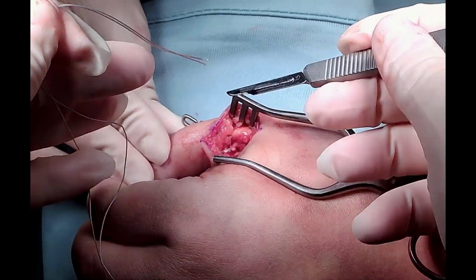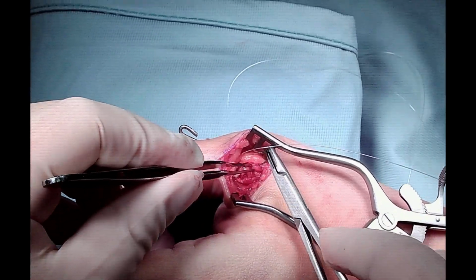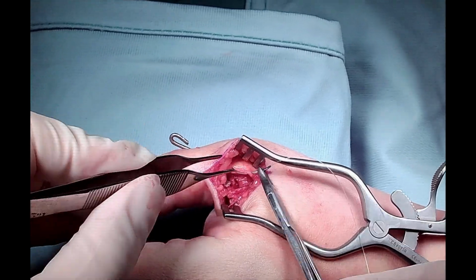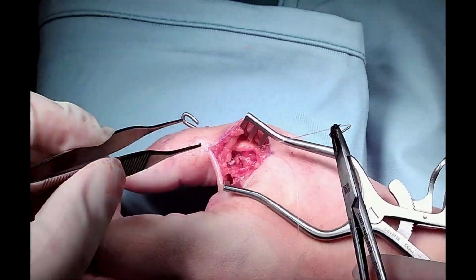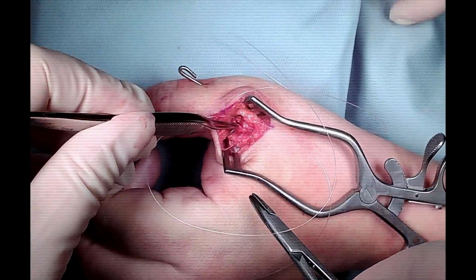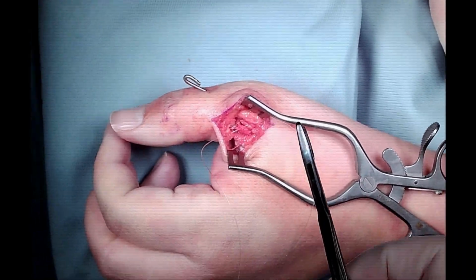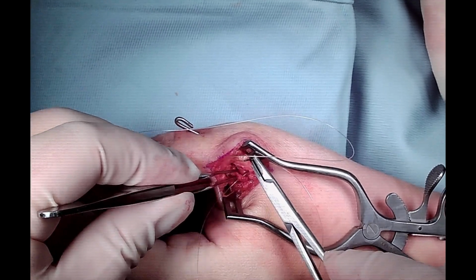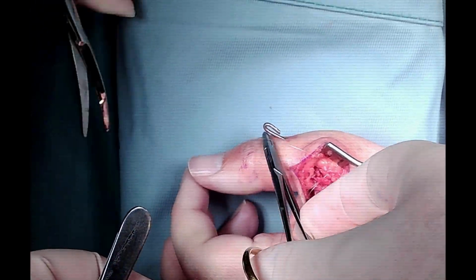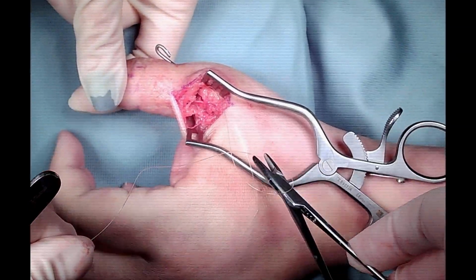So at this stage we finished reattaching the UCL back to its anatomical location at the ulnar side of the base of the phalanx, and now we are closing the aponeurosis with the 2 limbs in order to further augment our repair and close the soft tissue. This will help the repair of this area.